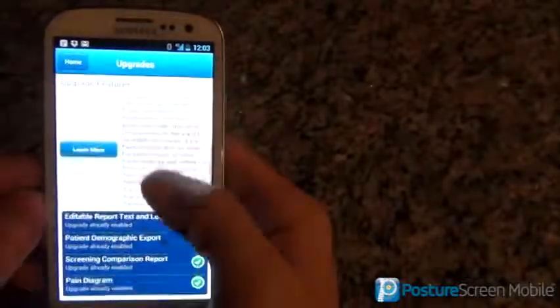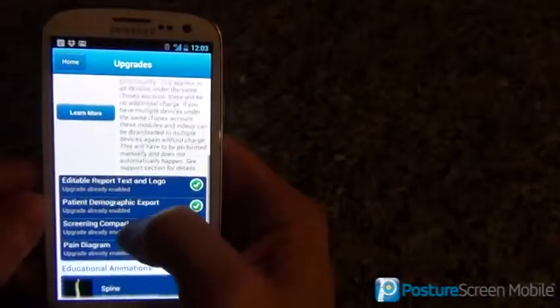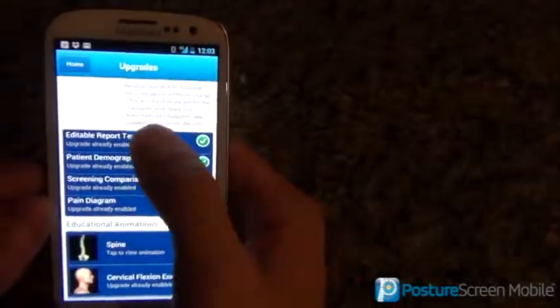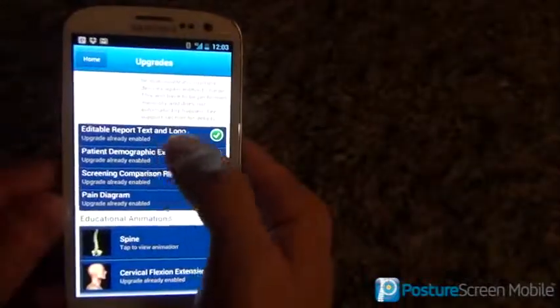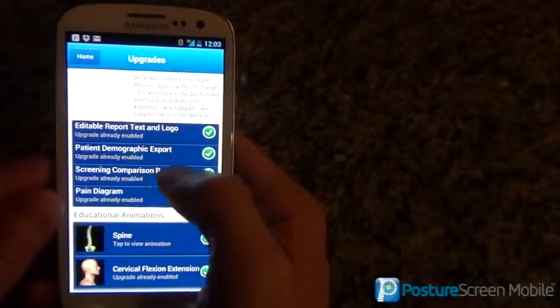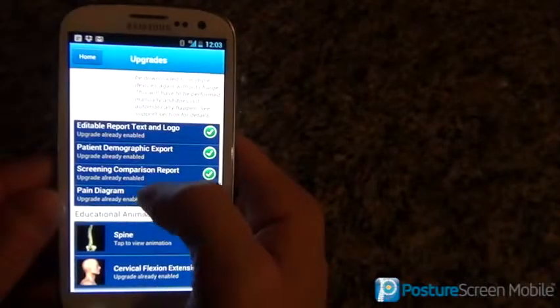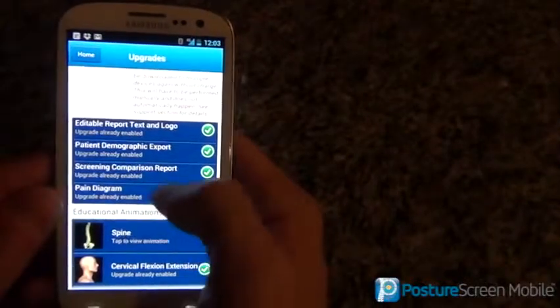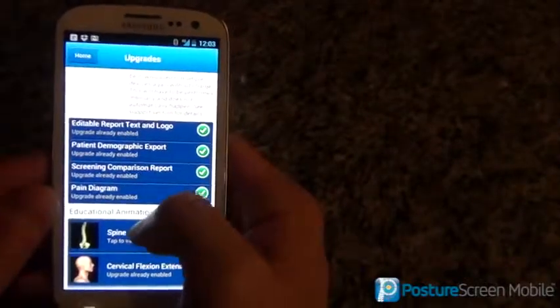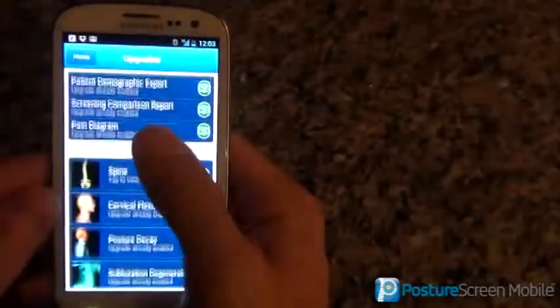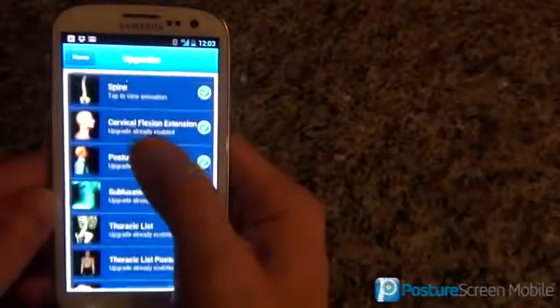With that being said, anything through here — the edit report module, patient demographic export, the comparison which we're going to discuss here, the pain diagram — those are all enabled, and these movies are also already enabled.